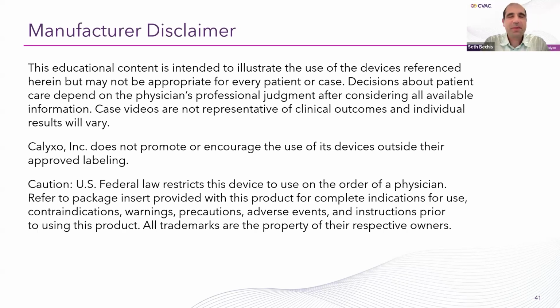And I would say I've also shifted my practice. I now use a stiff wire to place my ureteral access sheath. And if I'm putting the inner obturator, which is 12 French, in, if that goes relatively easily, but then I can't pass the full 12-14, that's the case where I may then place the CVAC up over the wire without a sheath. That's because the 12 French inner obturator is very similar in size to the scope itself. And I've had success using the CVAC without a ureteral access sheath in those scenarios.